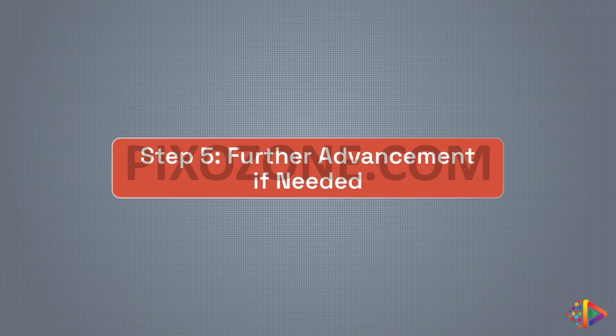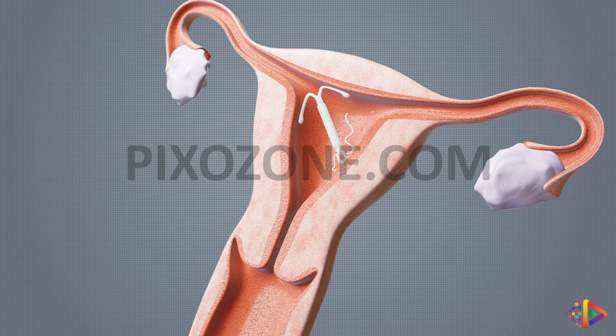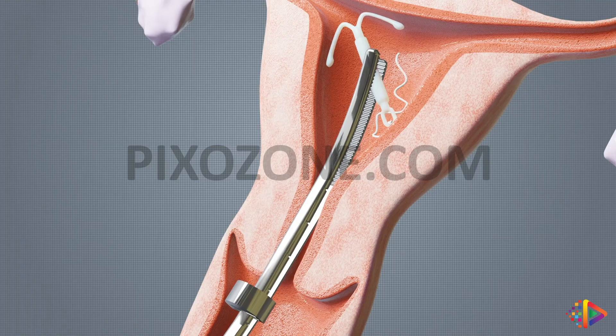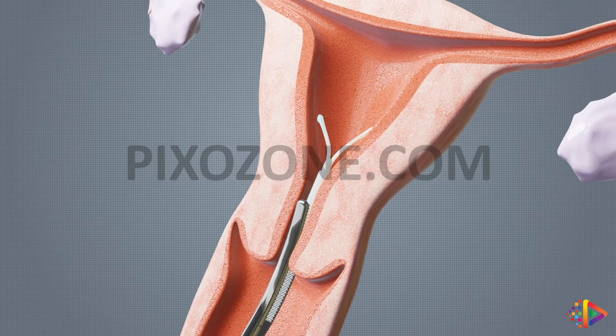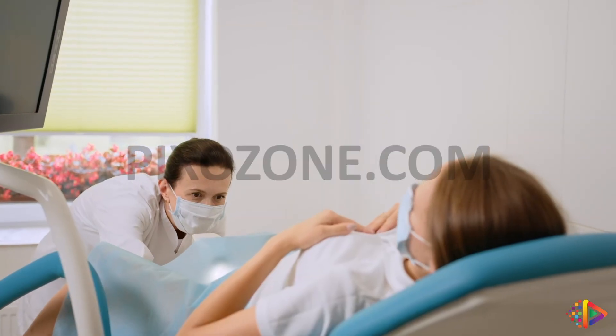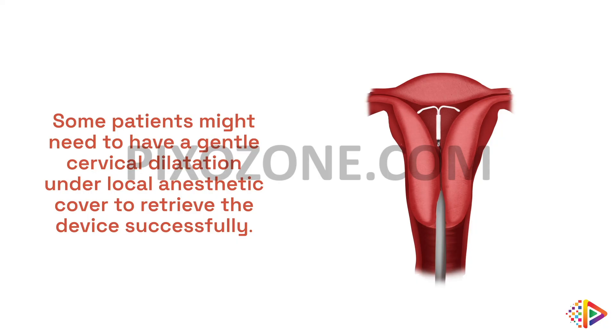Step 5: Further advancement if needed. If you still can't locate the IUD after following the instructions in Step 4, you can advance the IUD remover a little further into the uterine cavity, but remember to keep the flange at a safe distance from the external os of the cervix. Throughout the procedure, always ensure that you pay careful attention to the patient's comfort and safety. Some patients might need to have a gentle cervical dilatation under local anesthetic cover to successfully retrieve the device.